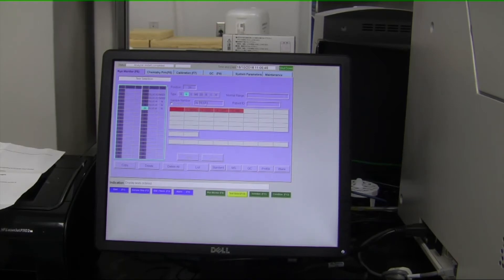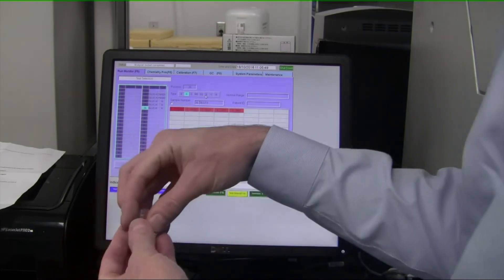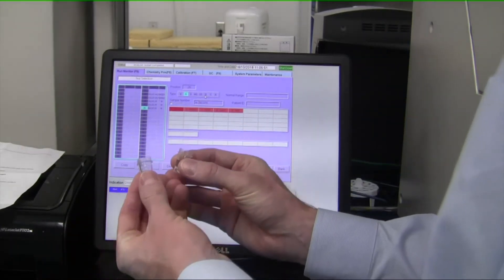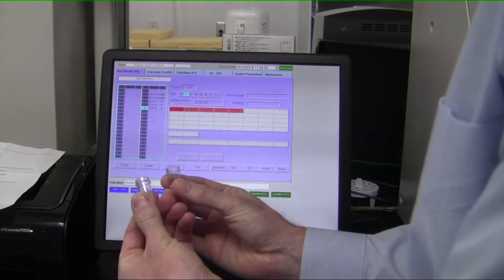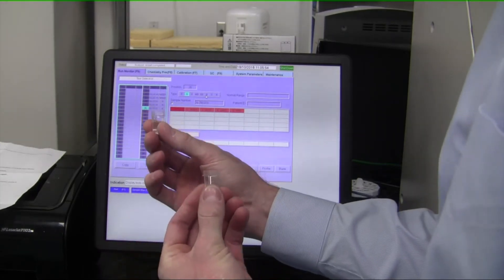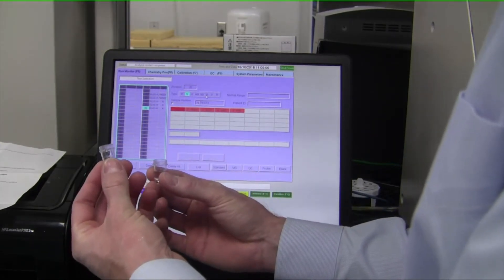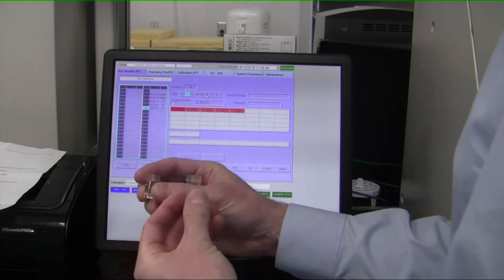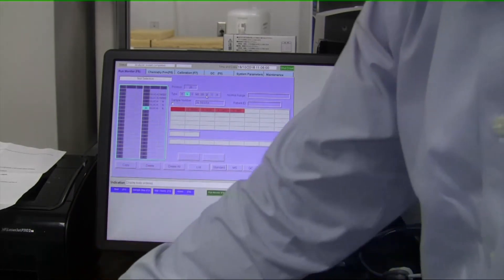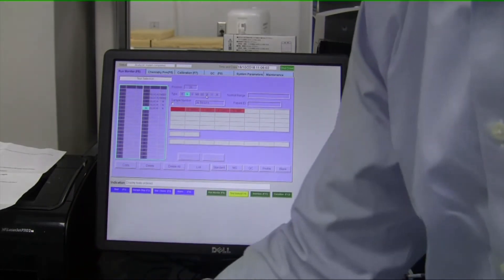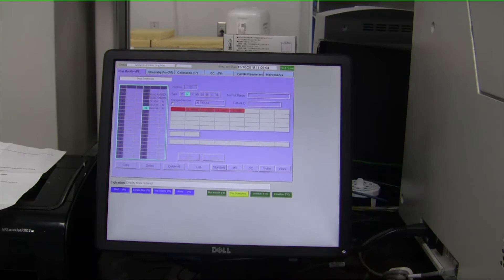So it automatically names the samples. It increases the number by one digit. If you wanted to change that, you could of course just type it in. And then here are the sample cups that are used—this is your basic sample cup. This is going to be your deionized water. I'll put some of the calibrator material in here for the two positions, and then we'll load on positions number 24, 25, and 26 with sample cups of unknown concentration, and those are going to be tested for glucose.